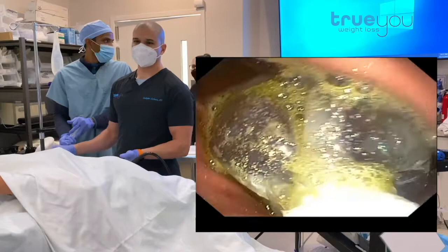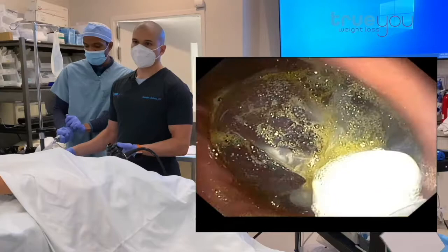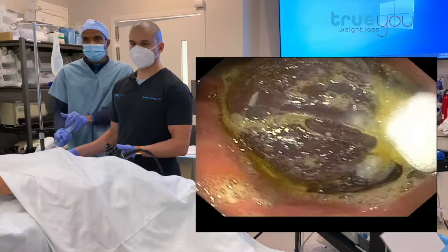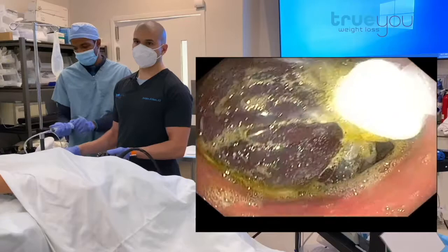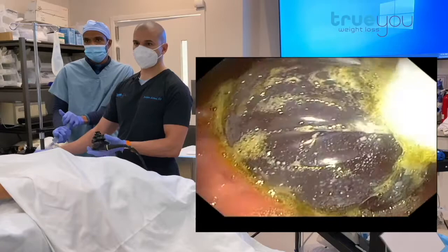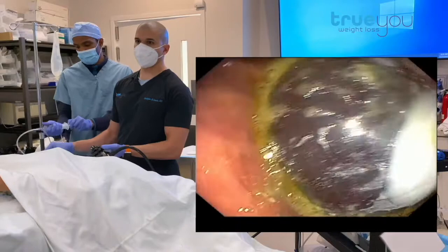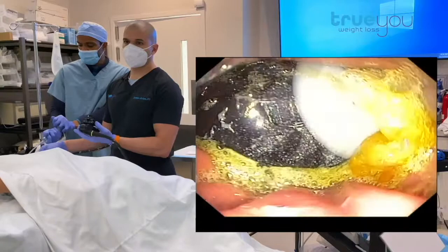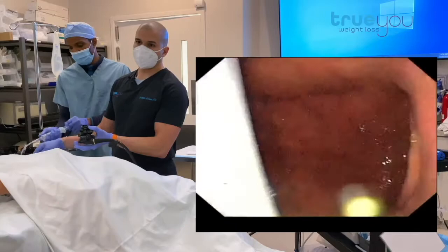Once we put about six syringes in, the balloon pops open completely. And now you can see it — it's fully popped open. The wrapper that was on the balloon has opened up and we're nearly finished. I'm going to start checking the sizing to make sure there's a little gap here where fluid and food can get by. We don't want it too snug and wedged in the stomach — this is looking good.